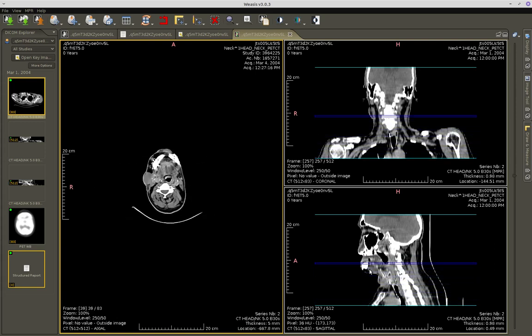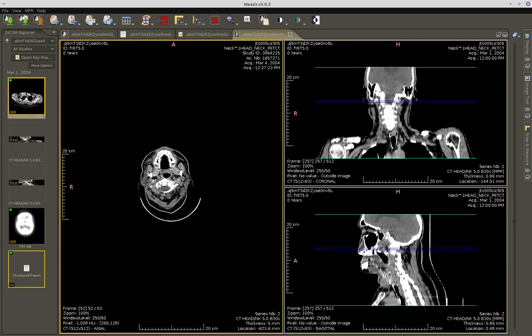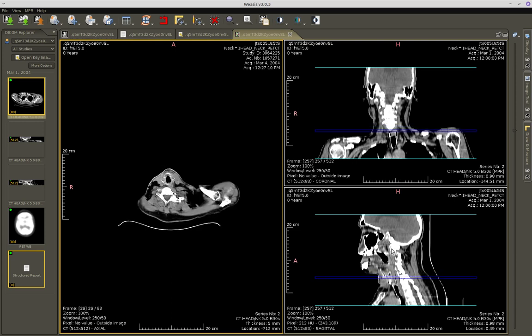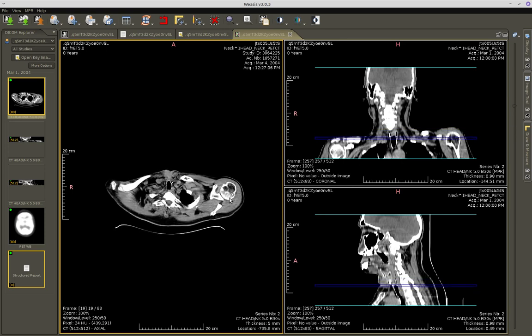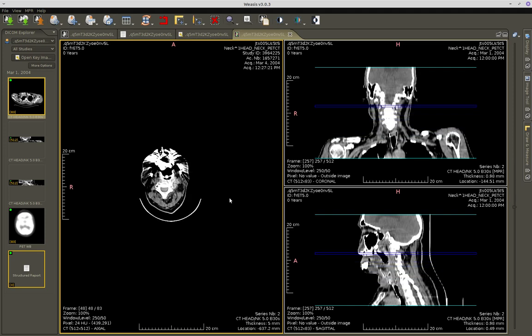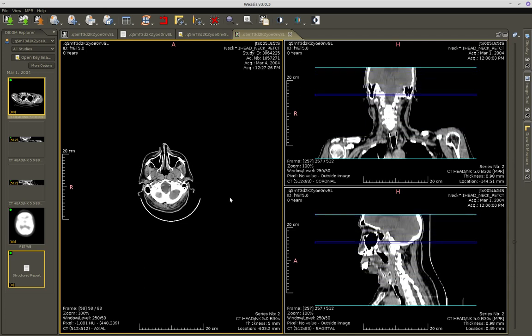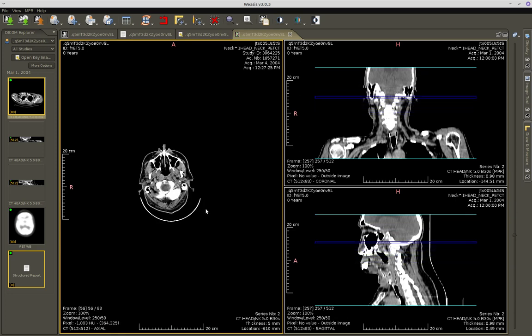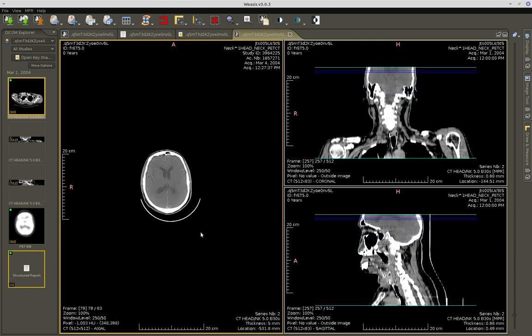And these are not perfect vertical cuts actually. This has some angle because you can see there that it starts cutting one shoulder. So this is maybe not a 90-degree cut, because you see some asymmetries starting there. There you see some asymmetries here.